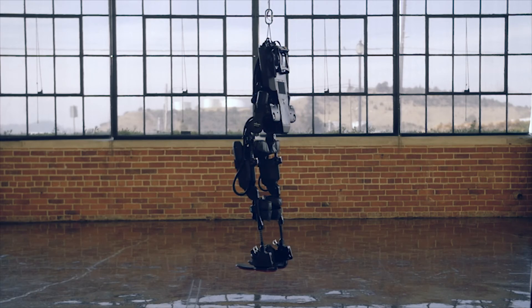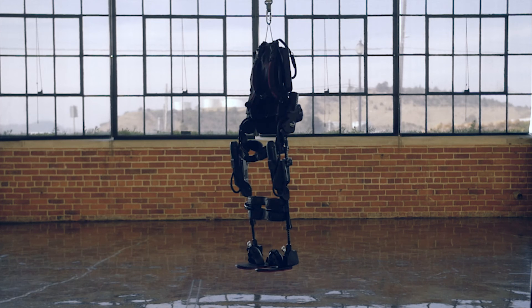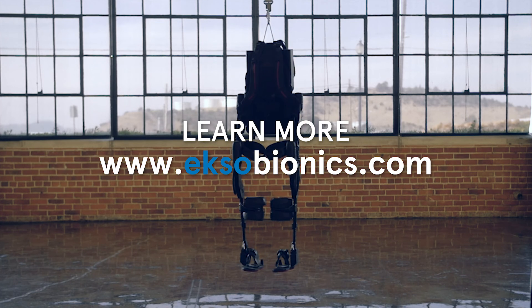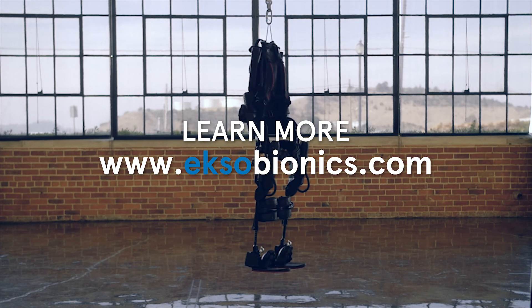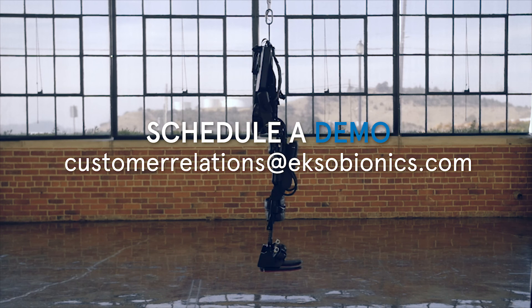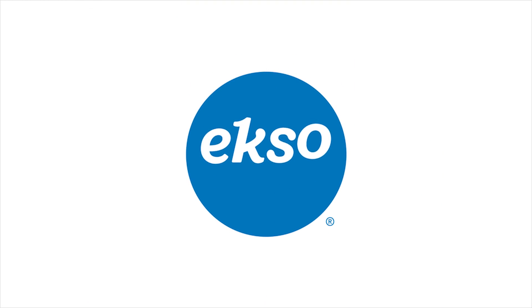We've only just scratched the surface of the versatility and capability of this dynamic gait retraining tool. To learn more about what the EXO-GT can do, visit exobionics.com and schedule a demo by reaching out to customer relations. Take the next step with us.